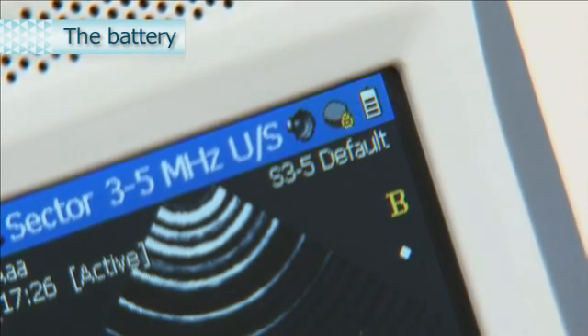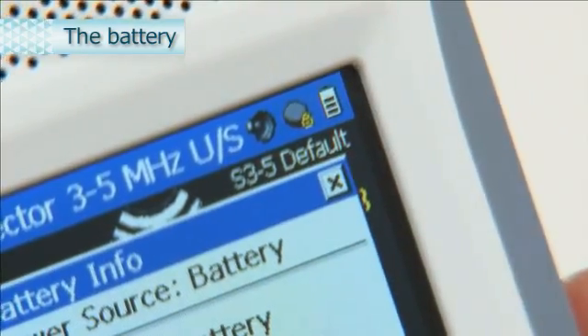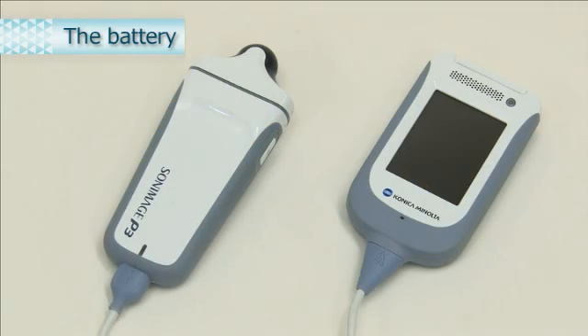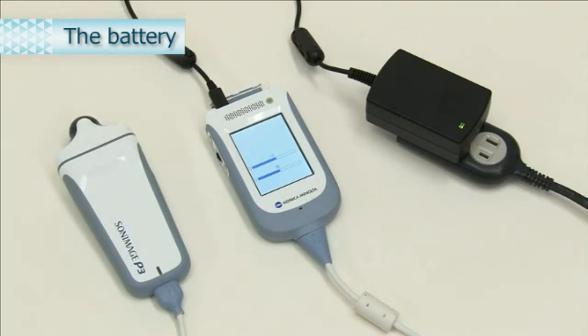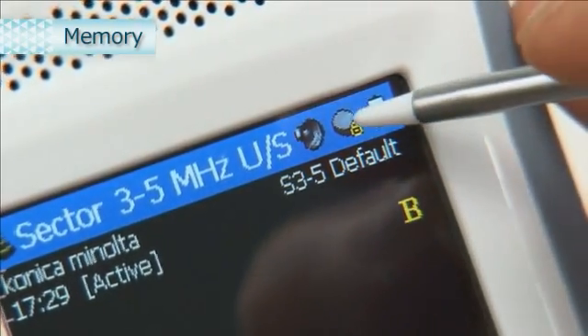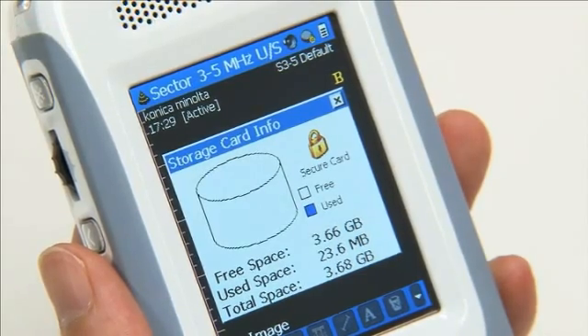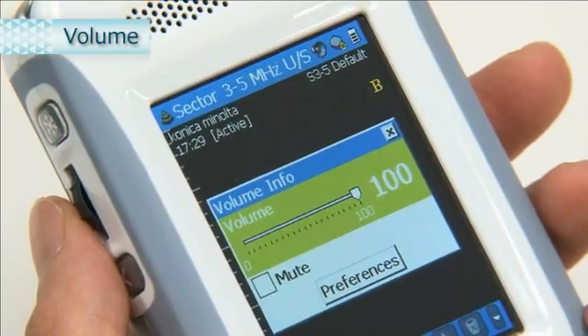To confirm battery status, click the Battery icon. Both the display unit and the probe unit contain a battery. If the battery is not sufficiently charged, the battery icon appears red. Be sure to charge the device using the included USB connection cable and mains charger unit. A full charge normally takes about 3 hours. Click here to confirm the capacity of the microSD card. Click here to adjust the volume. Check Mute to mute the sound.